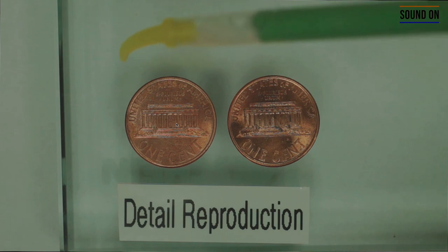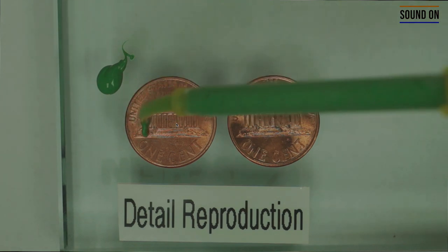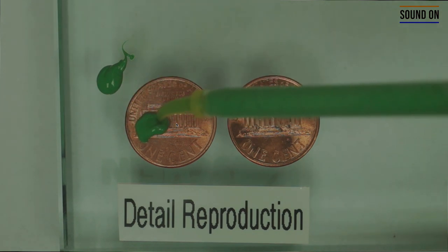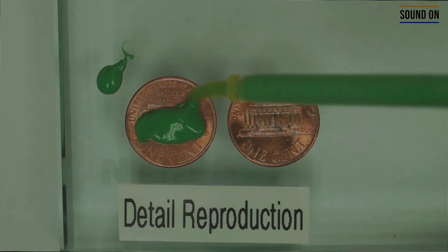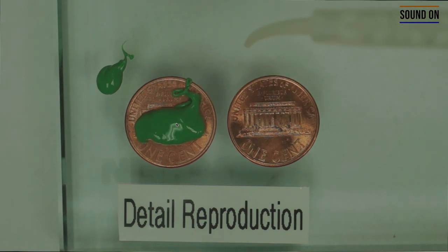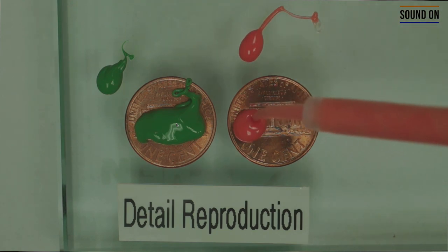You can use the intraoral tip to dispense the material and copy this area. You have to make sure to always touch the bottom part of the coin — that is the same thing you're going to do at the finishing line of a prep. On the left side use the PVS material, and on the right side use the light body polyether, making sure to touch the bottom of the coin and copy all the areas.